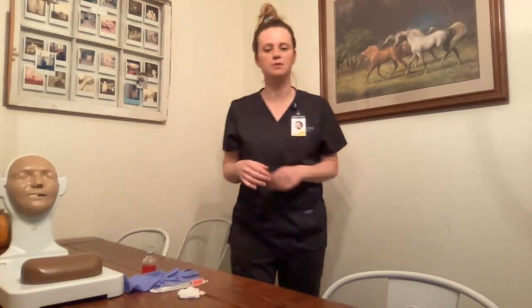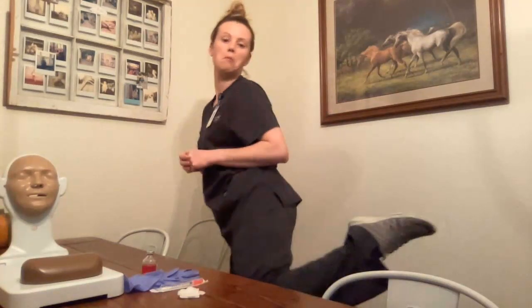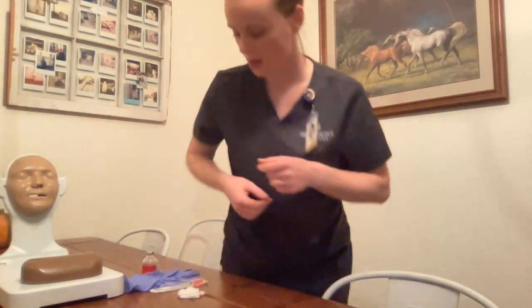Hi, my name is Emily. I'm going to be performing this skill video on Administration of Subcutaneous Injection. I'm in the appropriate school attire, wearing shoes, badge visible, no polish, no club nails, no jewelry.